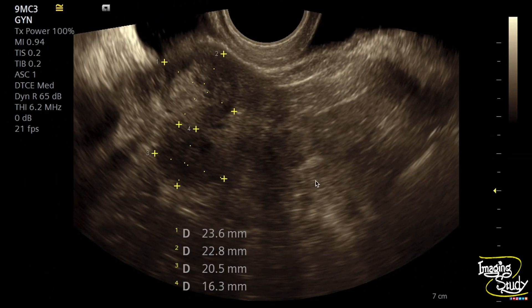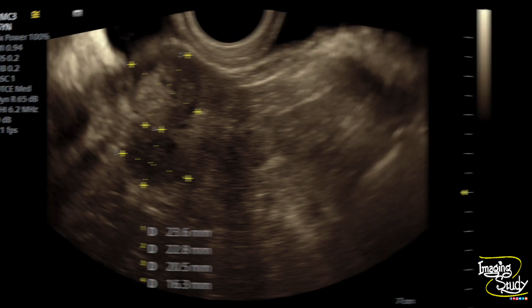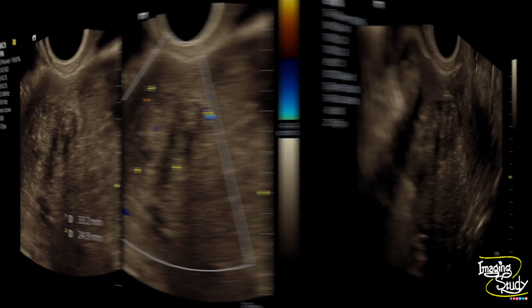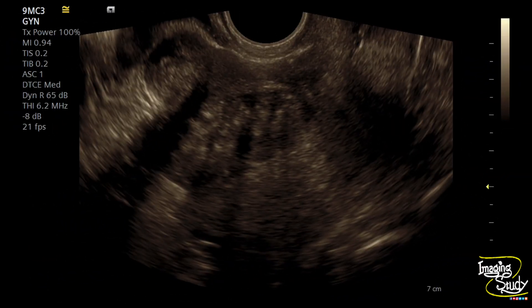Here's the measurement and you can see these fibroids. The intramural one — you can see this hyperechoic margin here. This hyperechoic line is the pseudo capsule. Another picture of the fibroids, and you can see this hyperechoic thin line is the pseudo capsule here as well.